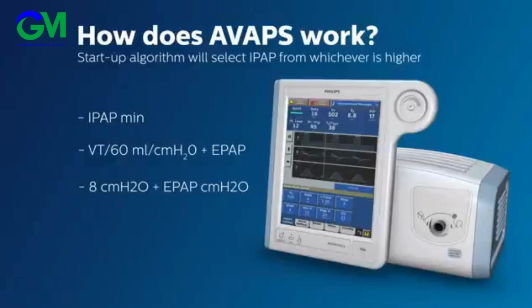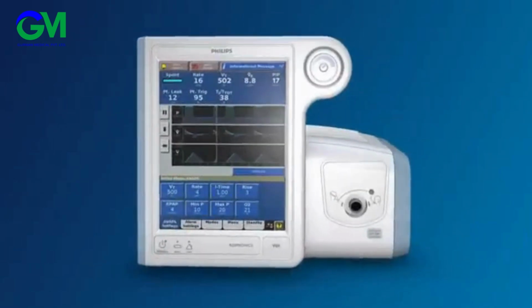Now that's really intelligent. Now you should have a better understanding of how AVAPS works and how you can use it to adjust to your patient's needs.